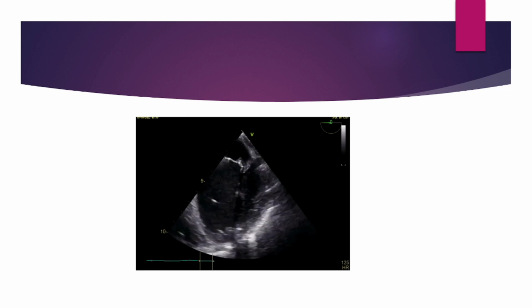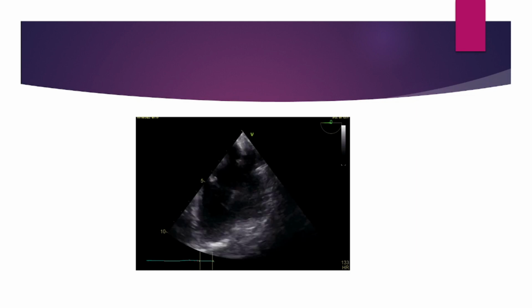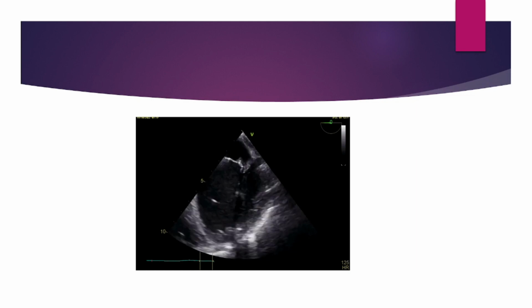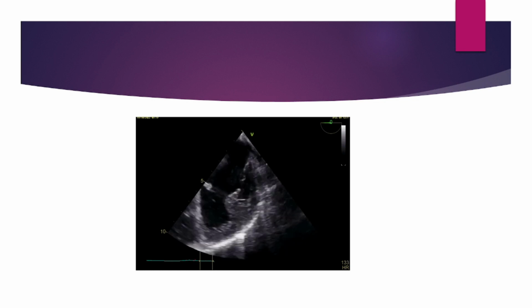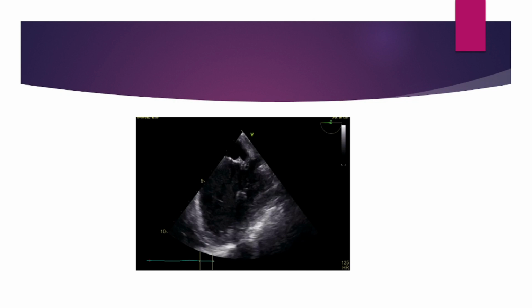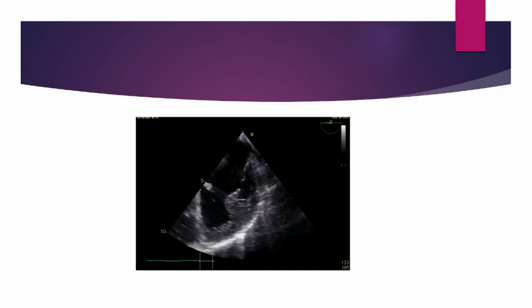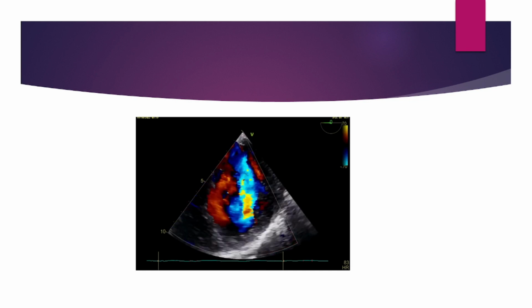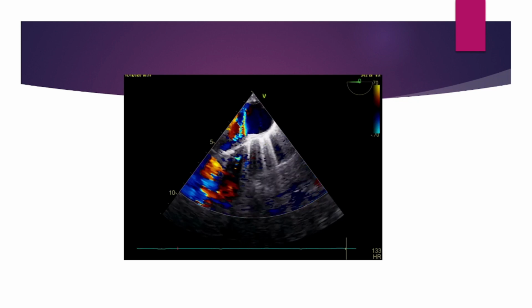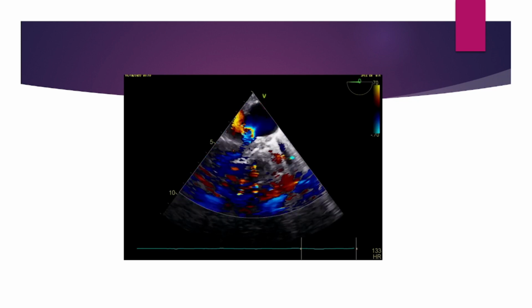Do you think this native mitral valve is normal, or do you think there is a rheumatic process? Or I'm really doubting if there are any rheumatic changes. Looks normal. It's not rheumatic. So you can see clearly the vegetation there and the severe mitral regurgitation on intraoperative TEE. And this is the patent ductus arteriosus with intraoperative TEE done.